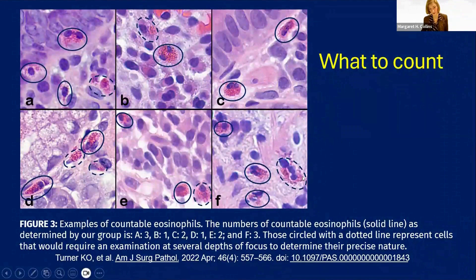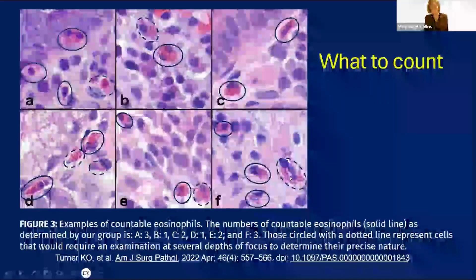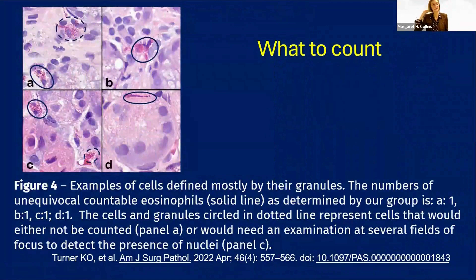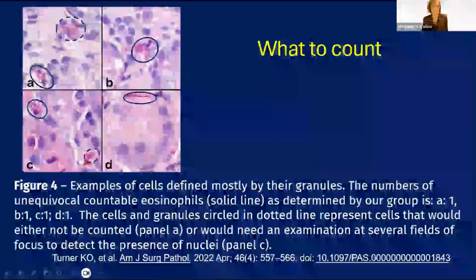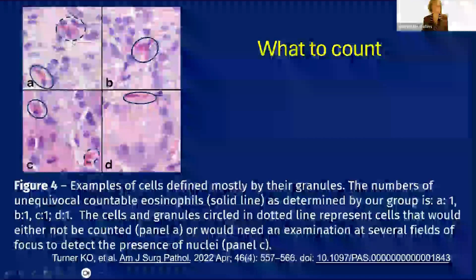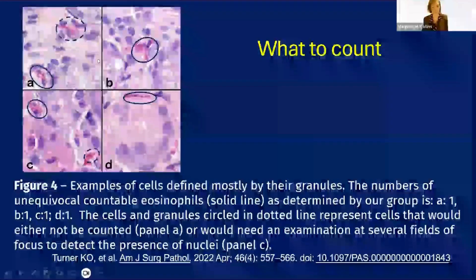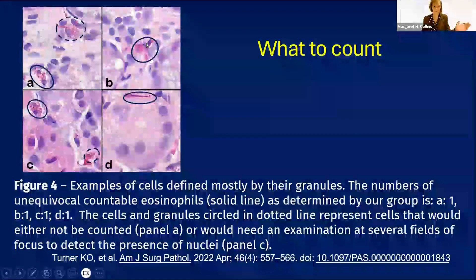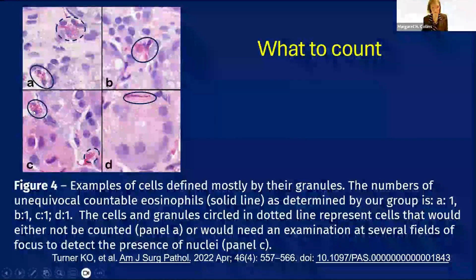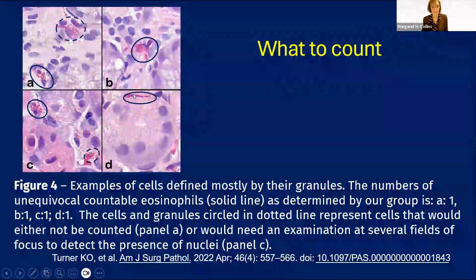This one is probably okay. They have a different shape from what you usually see. This one is okay — it's darkly staining. It's not round, but eosinophils move through blood vessel walls and tissue, probably changing shape while doing that. This one is probably also okay — there appears to be a nucleus in there, and if we could focus through a few planes of section, we could convince ourselves it's a darkly staining lobe of an eosinophil nucleus.